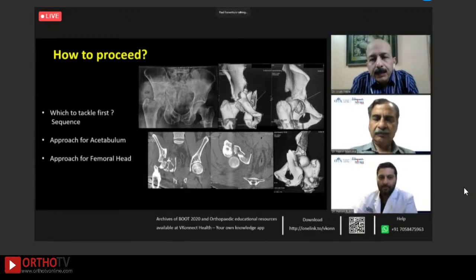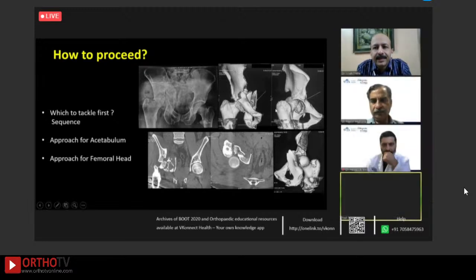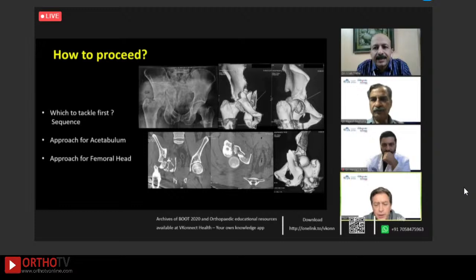Yeah, I think if you're doing it the way I do it, which would be to get the sure thing first, right? If I get the sure thing first, which is in the front, that's a very easy operation, and it's 100% predictable. And you're going to be able to dislocate out the back irrespective of what you do in the front if you choose to do a surgical dislocation. So I'm not worried about having trouble with that. And I wouldn't do it on separate days, because the front is a half hour, 40 minutes if it's a quick operation, and then I would turn it and do it the same day. I might even do it just in the lateral position. If it was a small patient, do the anterior approach lateral, push that down, and then just go right to the surgical dislocation.